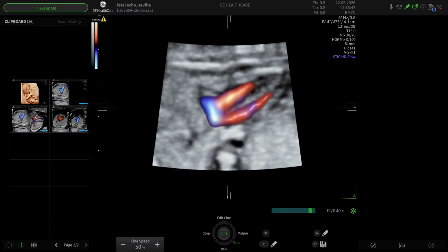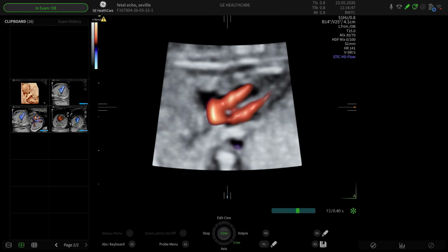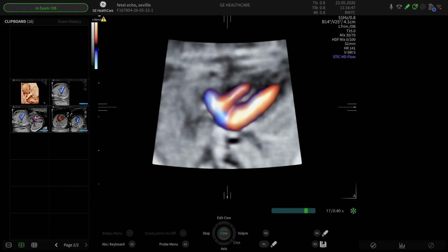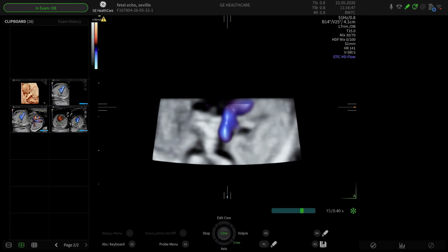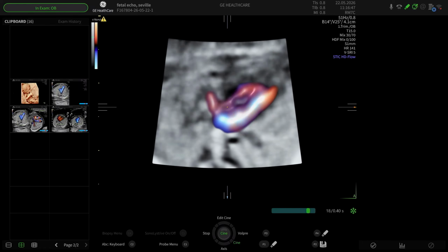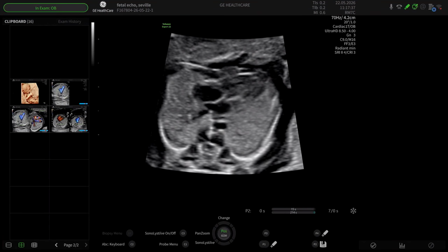And then I slow down the speed, and then I use this volume speckle reduction imaging, and I set that to a setting of 5. And as I do so, I then can very quickly demonstrate a sweep going up from the left ventricular outflow tract to the aorta coming out the left ventricle, and then up to the 3-vessel tracheal view. I just missed out on the 3-vessel tracheal view, and I saved that to file. And we'll be seeing many examples of the power of STIC during pregnancy over the next 2 days. But that's just an instructional outline of how to do a STIC evaluation.